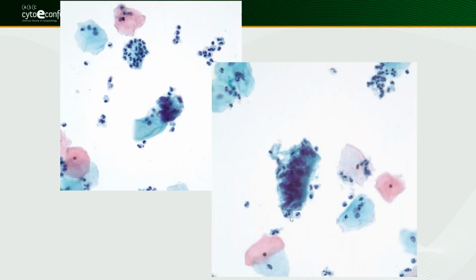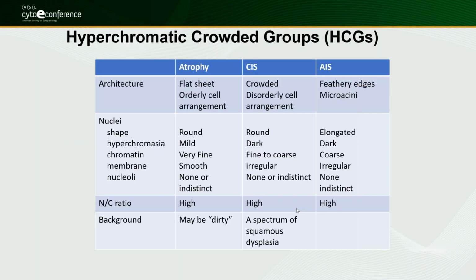And here it looks like atypical endocervical cells, at least favor neoplastic there. And again, we looked. This is definitely getting close to being AIS. Atypical endocervical cells favor neoplastic, again, elongated, hyperchromatic, and crowded nuclei.